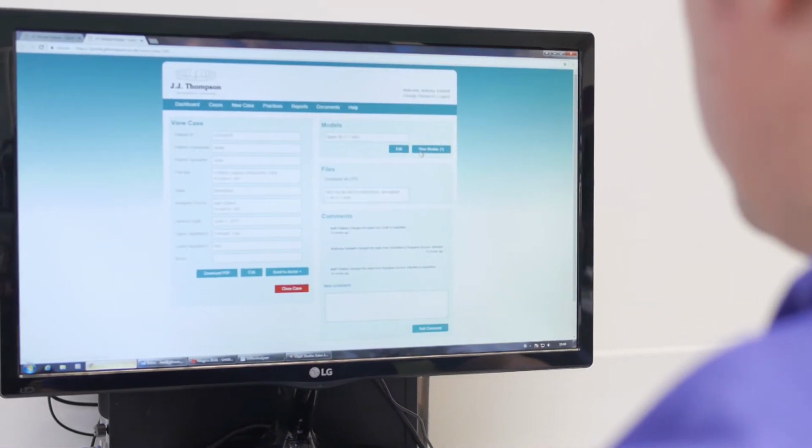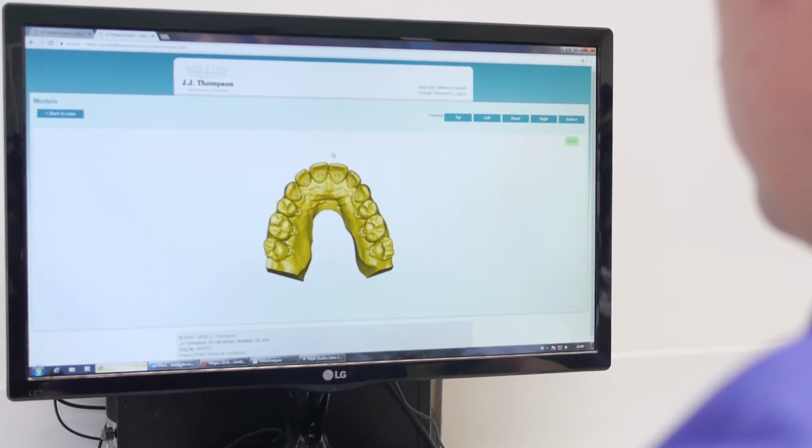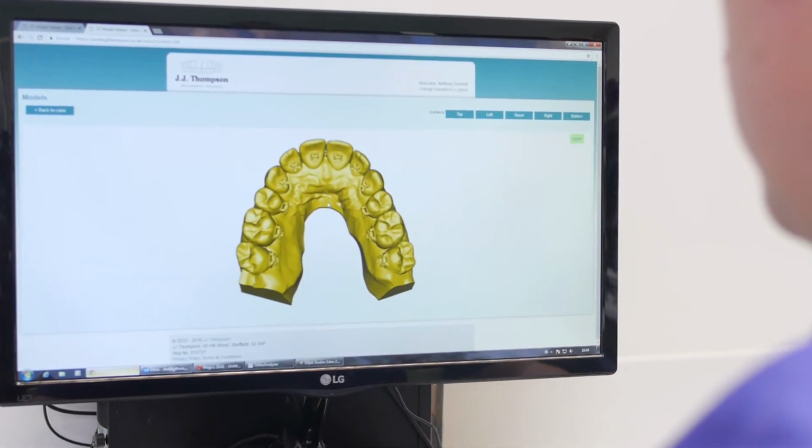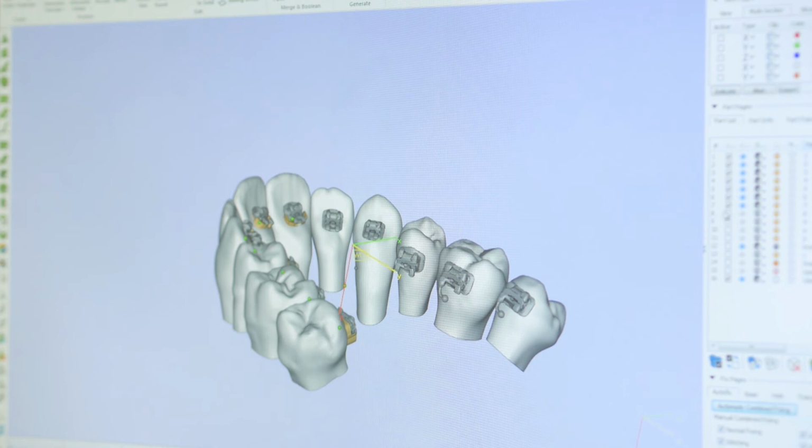It first starts with a case sent over to us by Dr. Chattu on our online portal. We'll receive the file from there and we generate a mapping of Dr. Chattu's brackets on the patient's arch. We then create a series of clasps around those brackets, and this is then attached to the pre-treatment model and sent to our 3D printers.